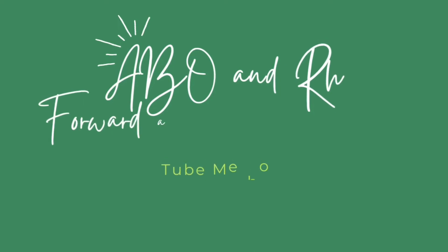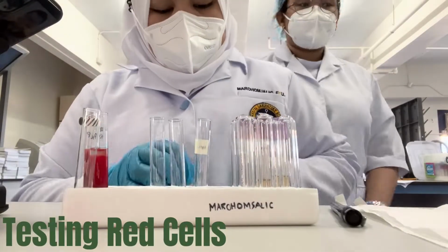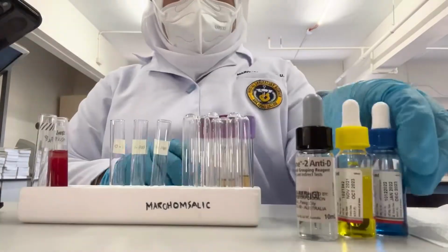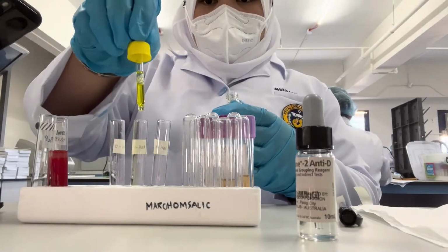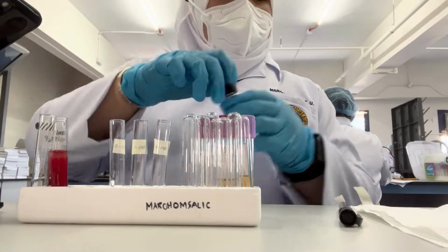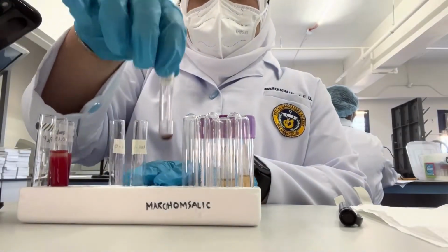Fourth is forward and reverse typing using tube method. First part is testing red cells. Label 3 tubes with anti-A, anti-B, and anti-D. Step 1, add 1 drop of each reagent on the corresponding test tube. Step 2, to each tube, add 1 drop of 4% suspension of red cells to be tested.